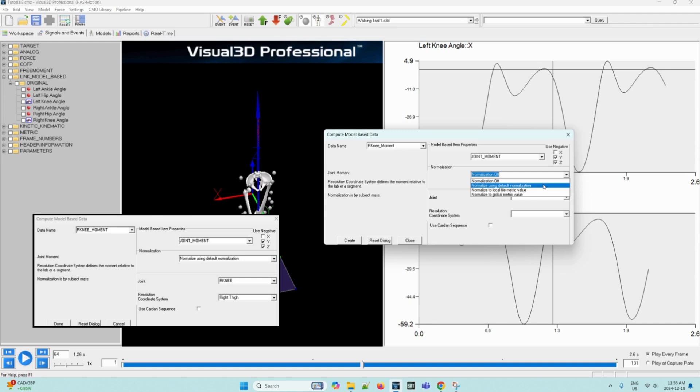For the normalization, we can set it to normalize using default normalization, which divides joint moment by the subject mass. A note is that any metric value can be used for normalization. As you can see, there are four options for normalizing the joint moment model based signal. There's normalization off, normalization using the default normalization, normalization to local file metric value, and normalize to global metric value. So of course, we can select the default normalization, and then the joint will be our knee. And then the resolution coordinate system is usually the segment proximal to the joint. So in this case, the right knee moment is resolved in the segment coordinate system by the right thigh. So we can select right thigh. And then we can click create.